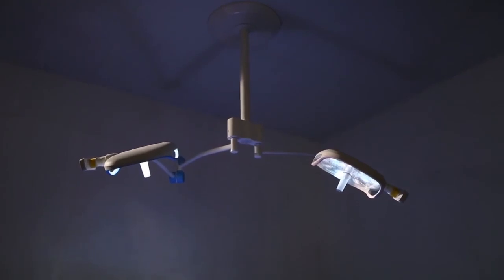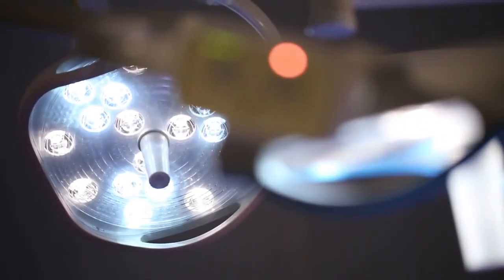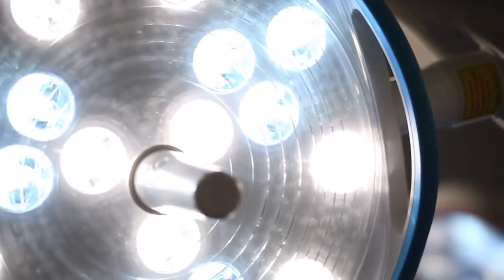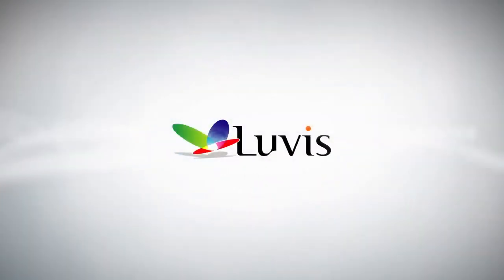Installation is completed. Experience the best operation lamp that will make the optimal operation environment for you. Luvis.